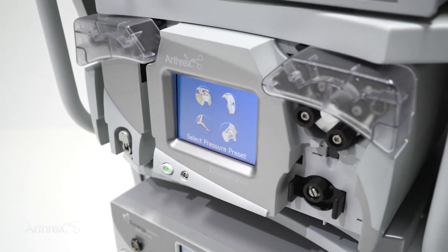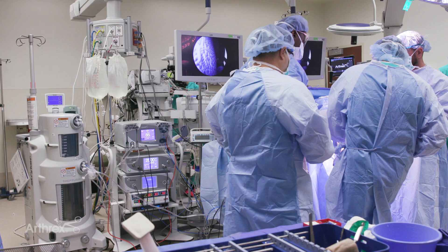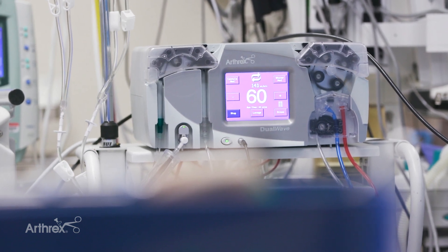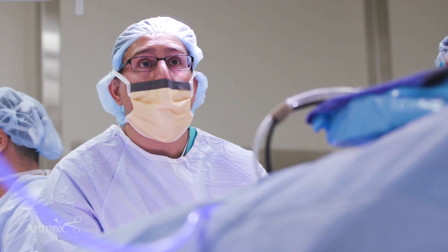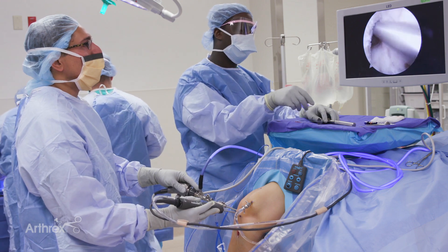I love the dual wave pump. I've been using it for over five years now and it's really become an integral part of my OR setup. The thing I like the most about the dual wave pump is its consistency. The setup is easy. I can personalize my own settings and regardless of where I'm operating, whether it's in the hospital setting or surgical center, I know I'm going to get a nice reproducible visual field.